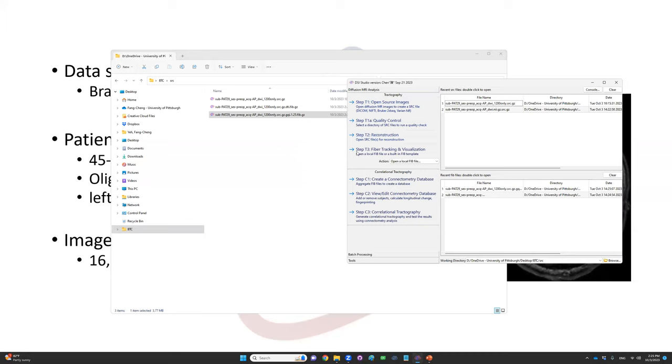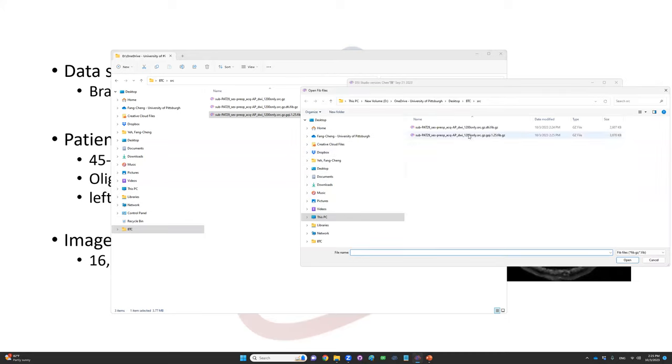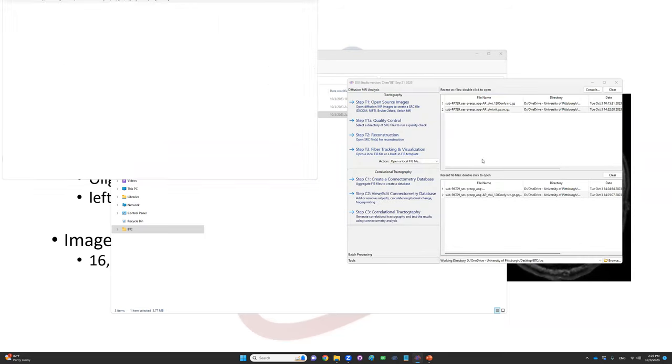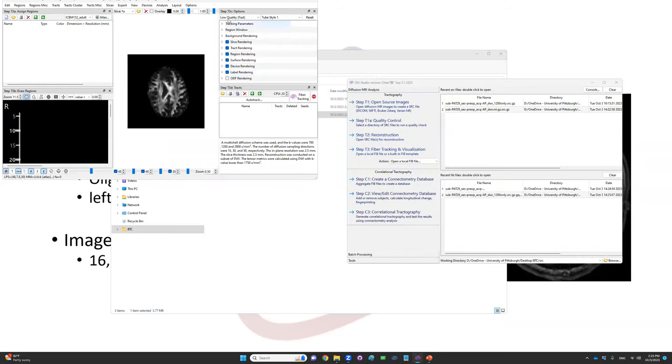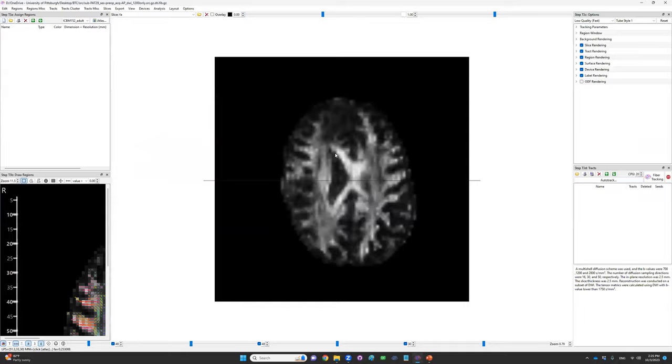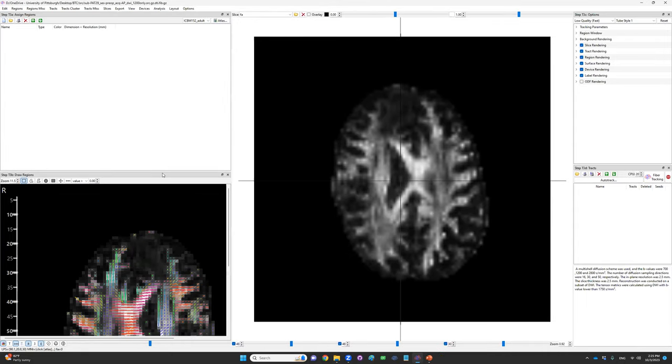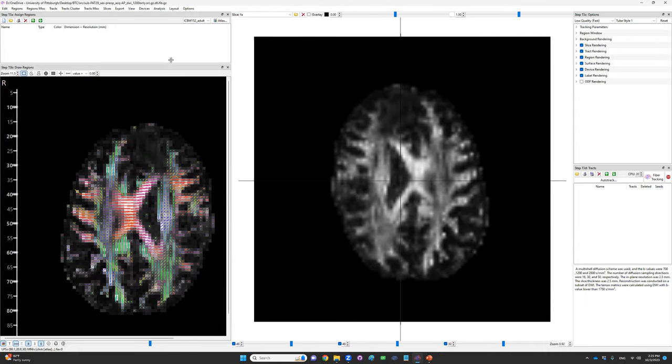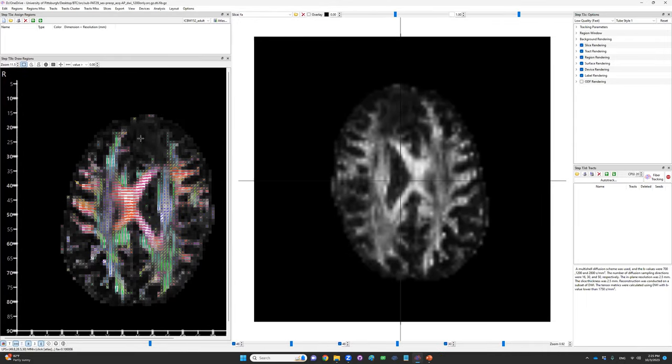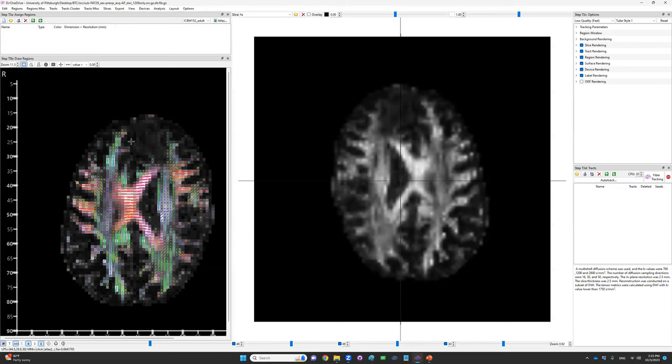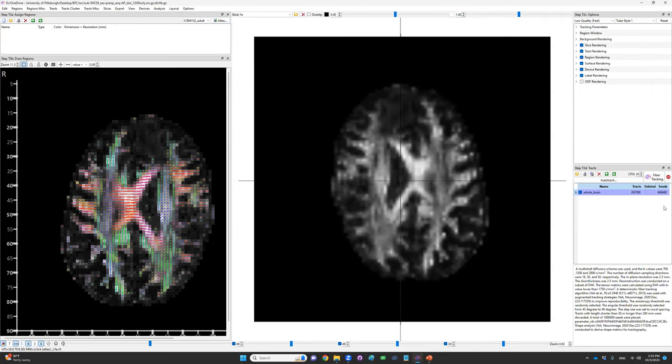Here we compare how they look in tractography. Click on step 3 fiber tracking and open the one generated from DTI method. The background map is the FA map, an anisotropy map suggesting the integrity of fiber pathways. If we look at the detail, those fiber orientations are resolved by the tensor model. You can see in the tumor region there's an empty region shown by the FA map.